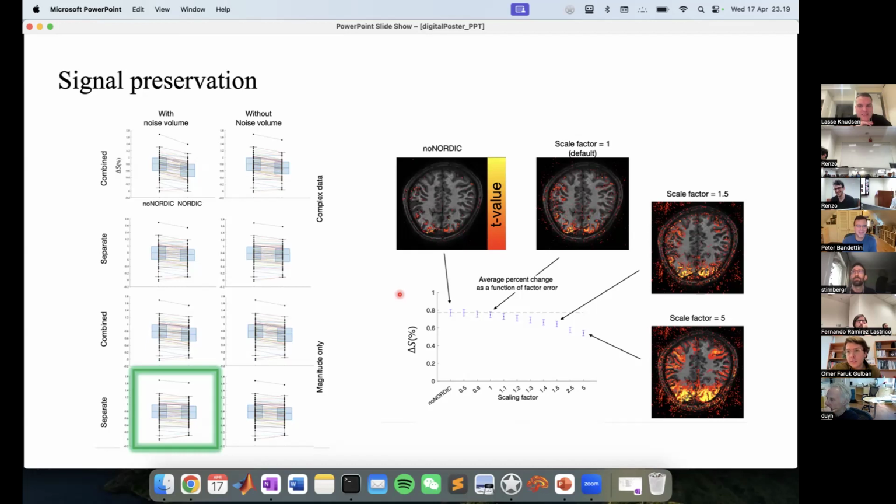Interesting. That's expected though, because NORDIC works over space and time, right? It basically concatenates the voxels over space and time and does a low rank reconstruction, which is like a projective version that is at the end like a summary. So you are basically simplifying the structure that you have in space-time. That is to me well expected, like reducing motion and other time effects. Yeah, it makes perfect sense, and it's a fun way to play around with the scaling factor and see these effects.